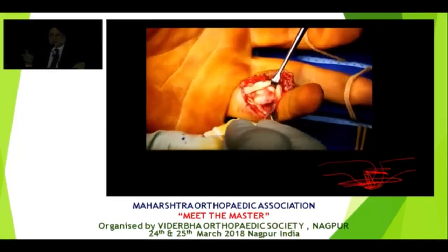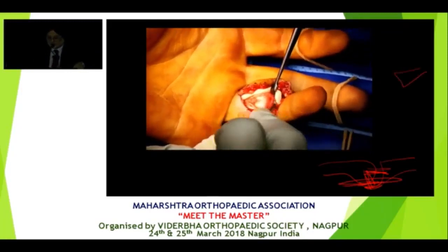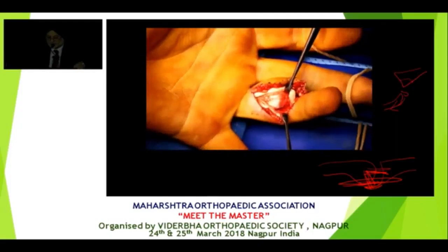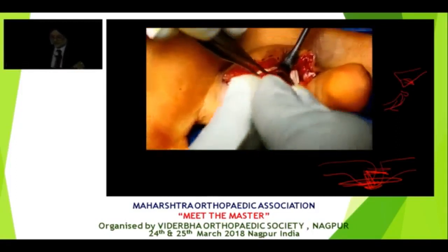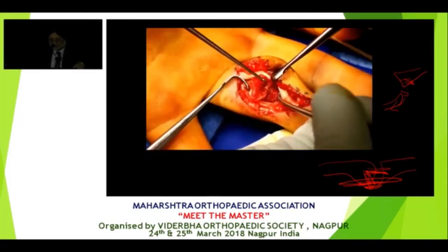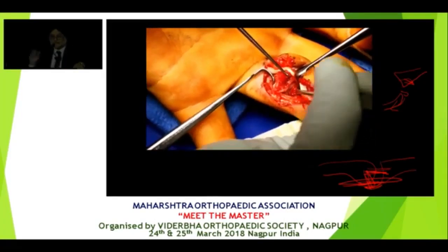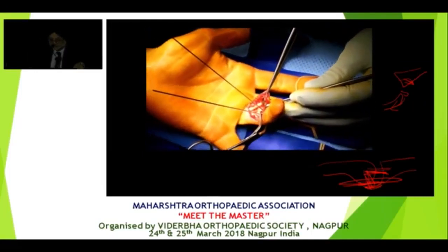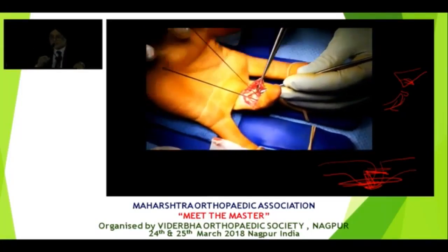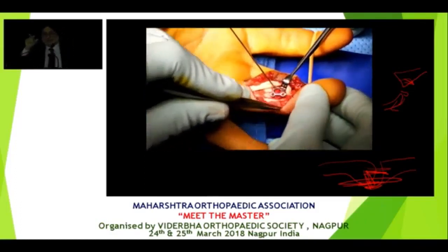Now, we're going to elevate the fragments with the volar plate. So this is your fracture. These fragments that are broken are being retracted along with the volar plate off. So we can get to the depression area here. So that's the volar part being reflected. And now we are correcting the depression. Yep. Using the proximal phalanx as a template. Then we've restored the volar fragment back, put some K wires, and now we are putting a small buttress plate on the front.